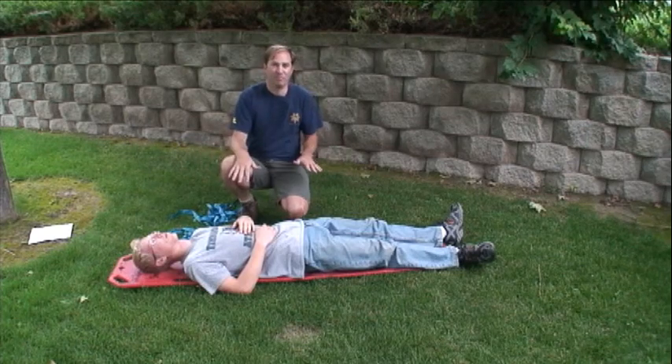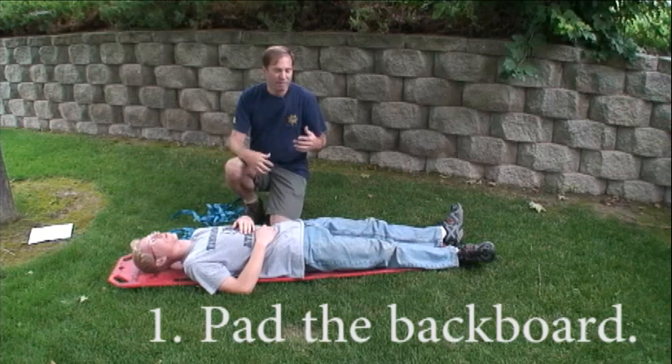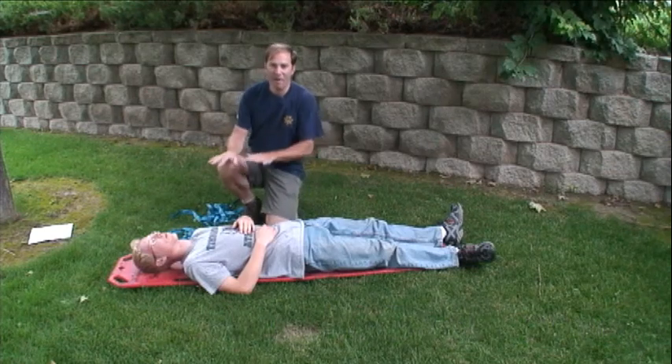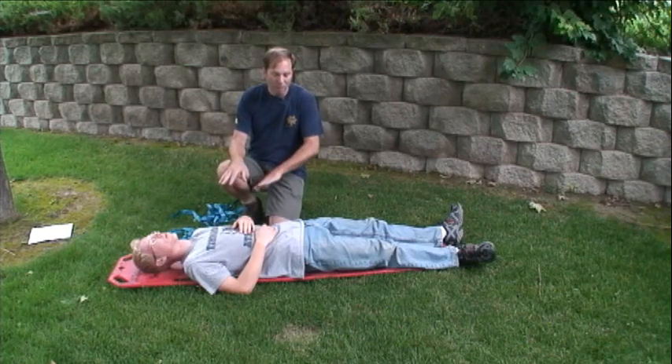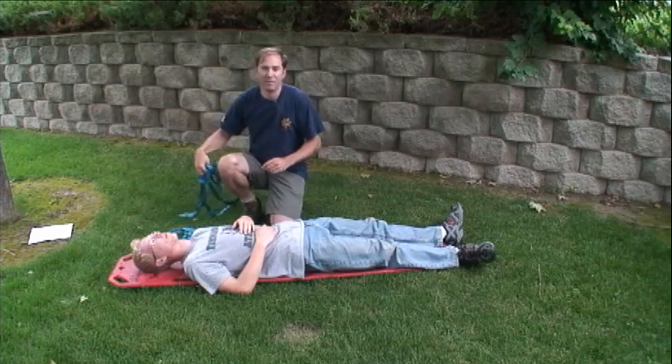First, remember the backboards can be very uncomfortable so always provide some padding, especially for long extractions. Pad not only the points of the patient's body that contact the board, but also provide support for arches like the lower back and behind and between the knees.